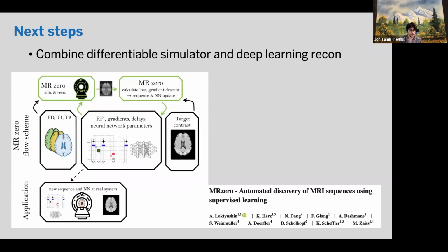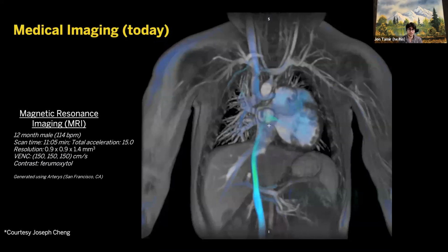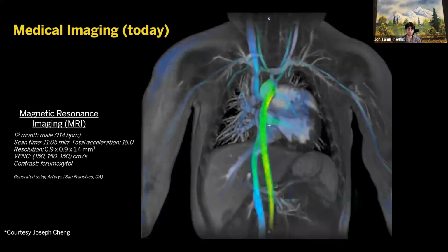This image that I started with, which is this nice dynamic imaging experiment, is way more complicated than that 2D setting. And so I think there's a lot of room to learn better acquisition and better active sampling in a setting like this, especially when we start talking about artifacts like motion.